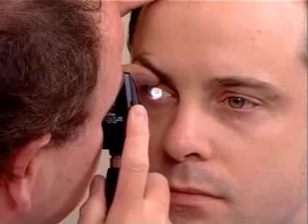Mr. Johnson, please look at the light. And at that last second, the patient's macula has looked directly at the light, and one is looking then at the fovea of the macula.